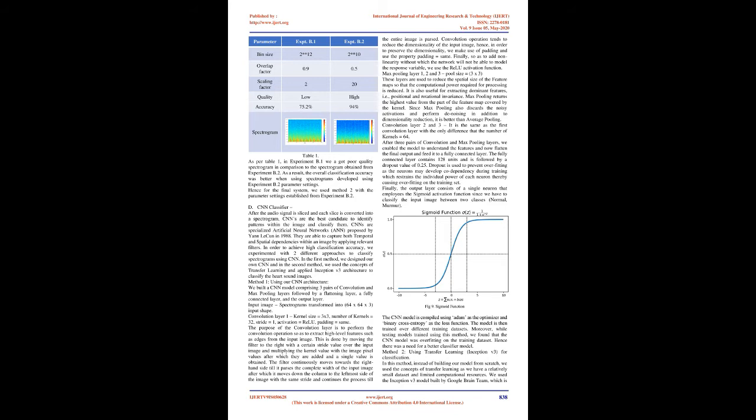The different window types are Hanning, Gaussian, rectangular, etc. The window type controls side lobe suppression. In our study, we used the Hanning window and experimented with other parameters to get sharper spectrograms and improve the overall classification score.